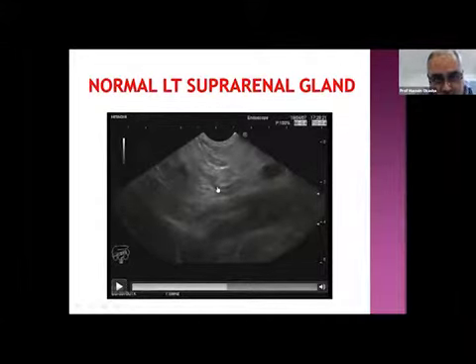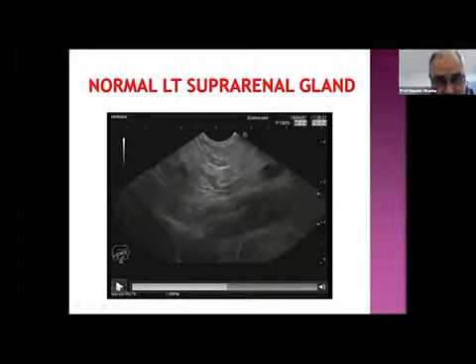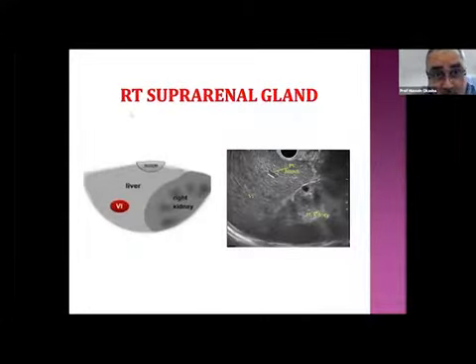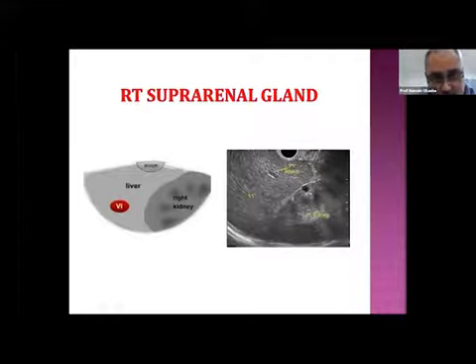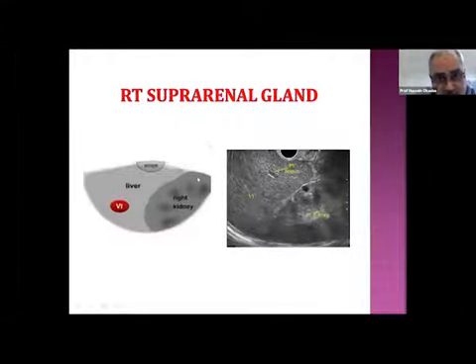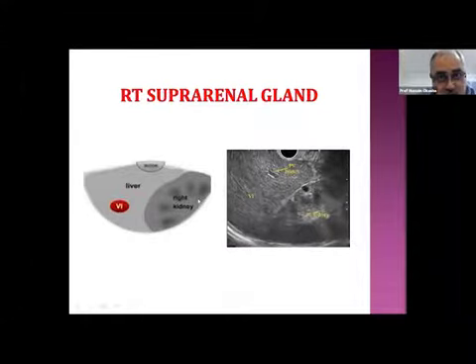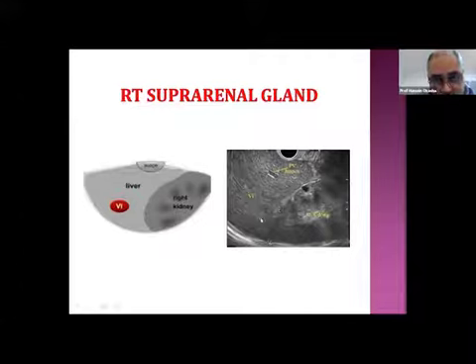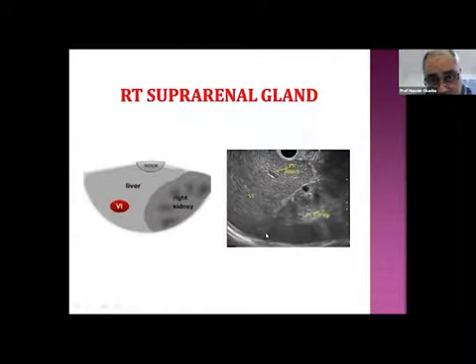This is the normal shape of the left suprarenal gland — the body of the seagull with a wing to the right and a wing to the left. Examining the right suprarenal is very difficult. If there is a large mass, we can see it, but visualizing the normal right suprarenal is very hard. We position the echoendoscope in the second part of the duodenum and rotate clockwise to see segment six of the liver and the right kidney.